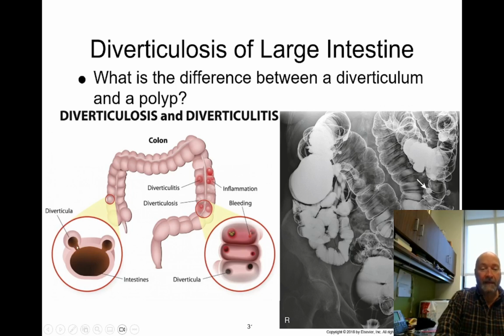And if it's pedunculated, meaning that you've got a skinny stalk, that would be an indication of just a benign polyp. Your precancerous polyps tend to have a broader base to them, so they project inward, and instead of projecting in kind of like a bubble, they project inward more like a lump.